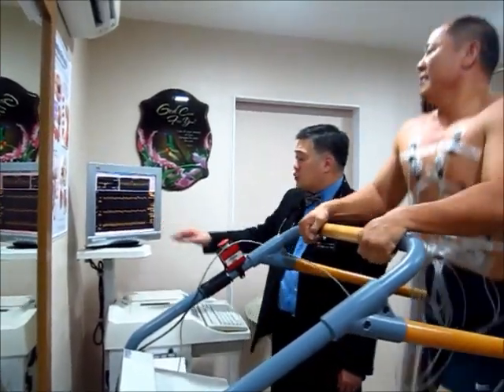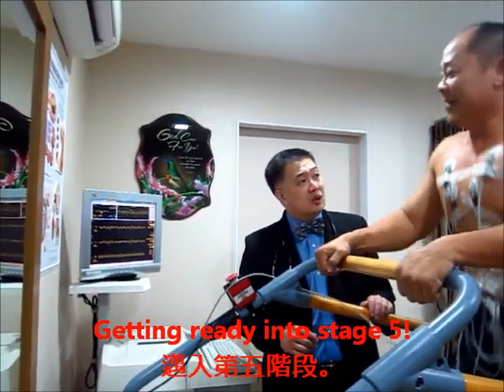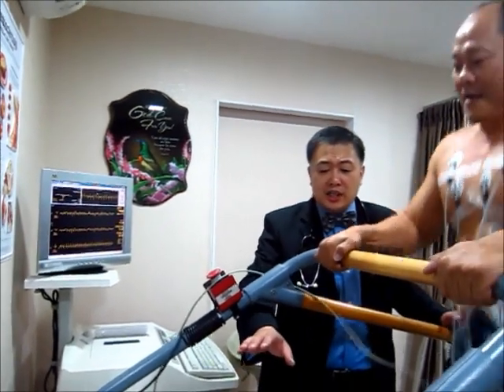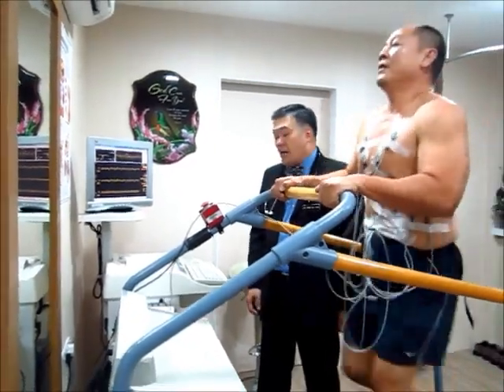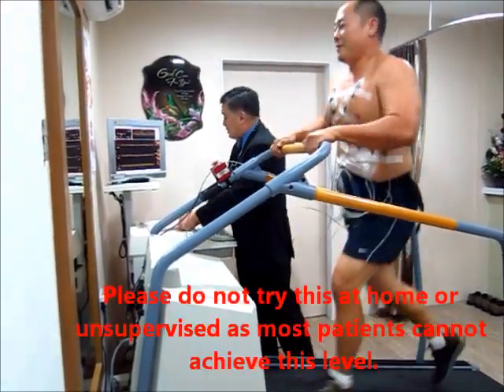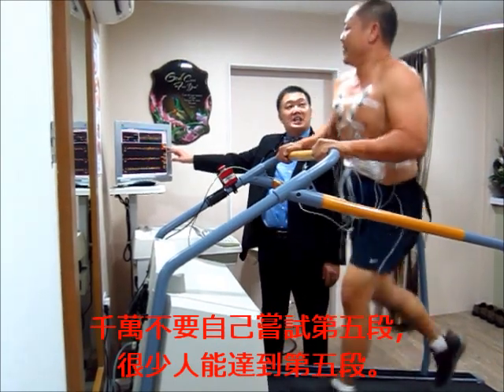Mr. Koh, you have another 20 seconds before stage 4 ends, doing 97%. Would you like to go to stage 5 to reach 100%? Let's give it a try — you are doing 98%. In another 10 seconds the machine will rise higher and the speed will pick up; all you need to do is run a little faster. Any chest discomfort? No. Super — this is a superb performance, really good.